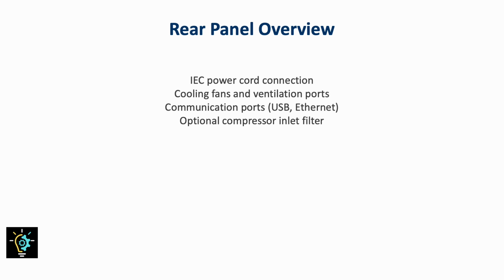Moving to the rear panel, this side is geared more for engineers than clinicians. It houses the IEC power cord connection, which supplies electricity to the system. Cooling fans and ventilation ports are visible, keeping internal components at the right temperature. You'll also see communication ports like USB and Ethernet, essential for software updates, data transfers, and sometimes even remote monitoring.